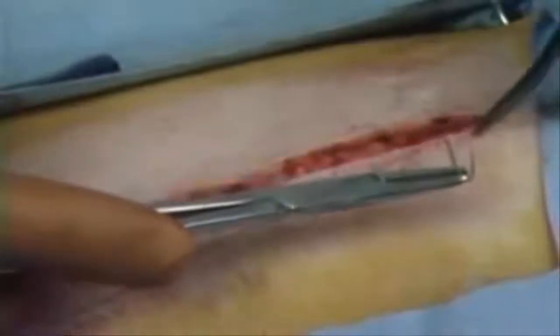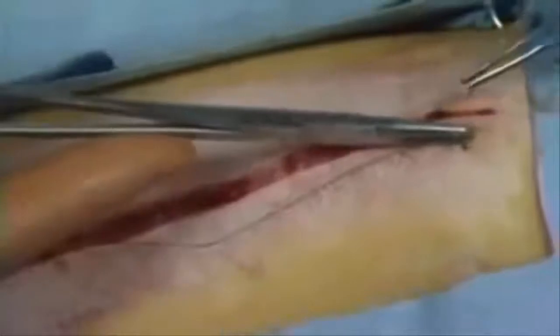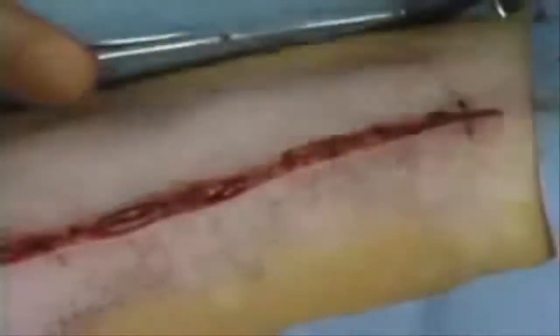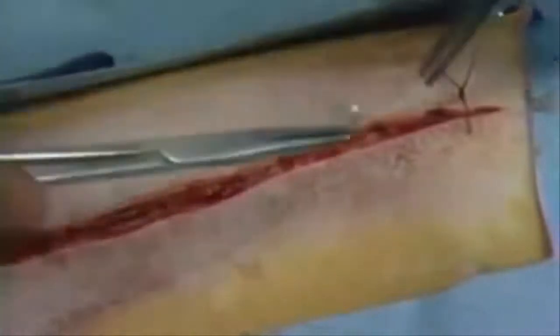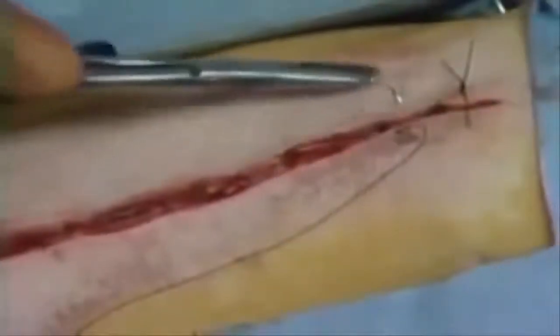A number of suture patterns have been described for use in animals in various organ systems and surgical situations. The fundamental technique and knowledge of suture pattern placement is critical to the success of any surgery. Understanding the suture pattern's tendency to oppose, evert, invert, or tension relieve helps the student rationally choose a pattern best suited for a given surgical problem. This tape will cover techniques only. The student is encouraged to review in current surgery textbooks the specific suture patterns and their indications.